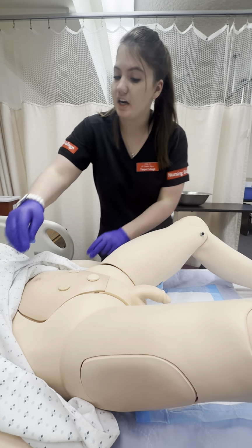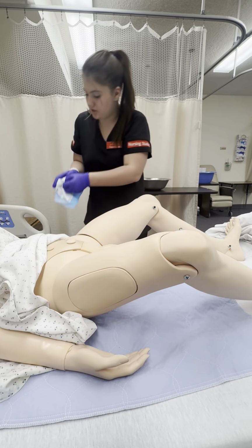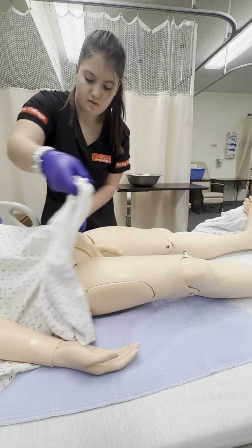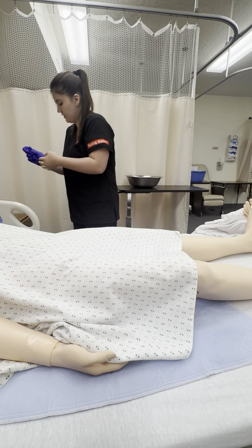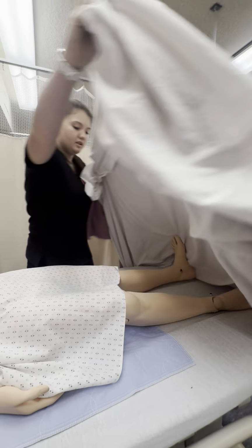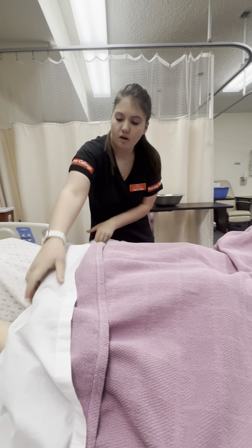Okay, I'm gonna go ahead and cover you back up, okay, Jerry? Okay. Okay, I'll remove those chucks. Get you back into position. Put that back down. We can remove my gloves. Perform hand hygiene. All right. Looks like we are all set.